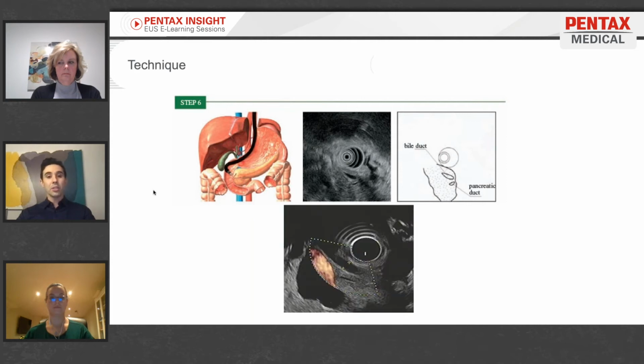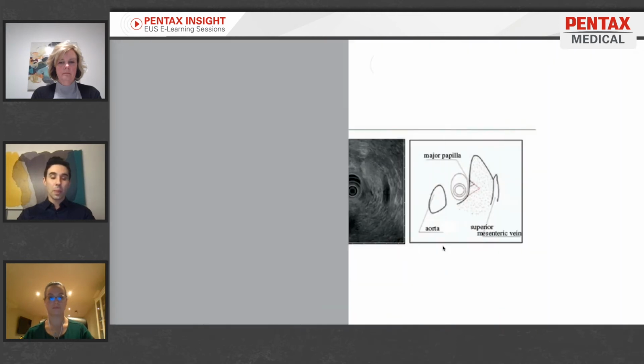And again, same thing here. So if I were to show this cartoon here, there's our pancreatic head. I have a large vascular structure, which I know is the portal vein. And then I have two smaller anechoic structures, you can see, that are not turning red on my Doppler window, which is this portion here. This is a Doppler window. This is not turning red, so I know they're anechoic but not blood-filled, and so therefore I deduce that they're some sort of other fluid-filled structure. And so this is the common bile duct on the top and the pancreatic duct on the bottom.